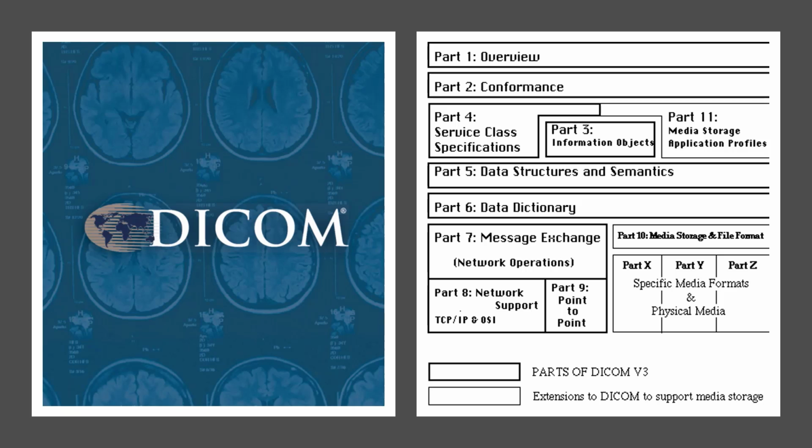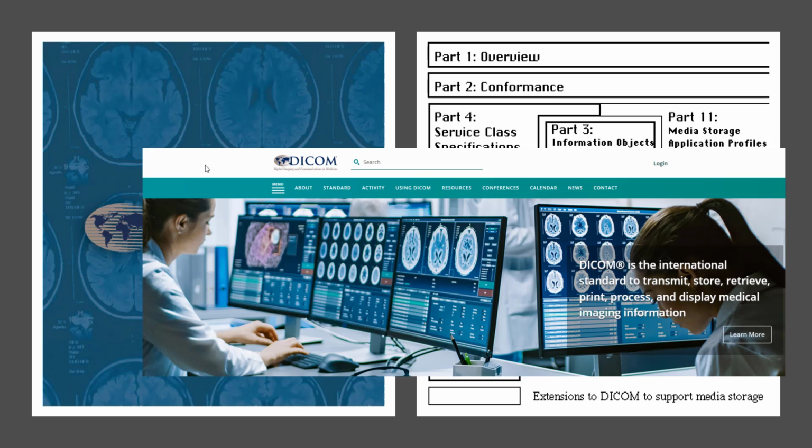Today, we just look at the DICOM standard, not by version, because the DICOM standard can be seen on the internet and it can be accessed at any time with all of the updates by those that oversee DICOM conformance standards, DICOM equipment standards, and DICOM service class specifications, and all the portions that create DICOM, Digital Imaging Communications in Medicine.